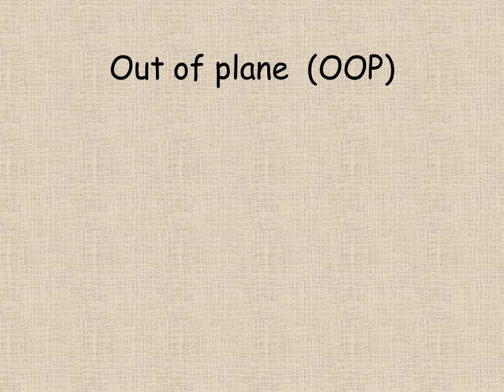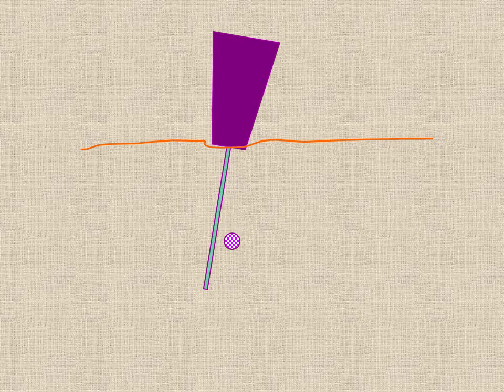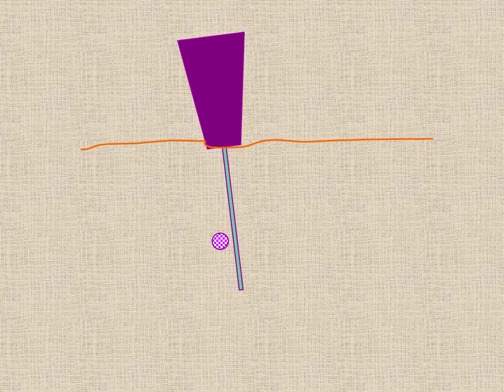Approaching nerves with the needle out of plane. The ultrasonic beam is very thin here. If we move away by a small amount in either direction, we will be unable to see the nerve because the beam is so thin.